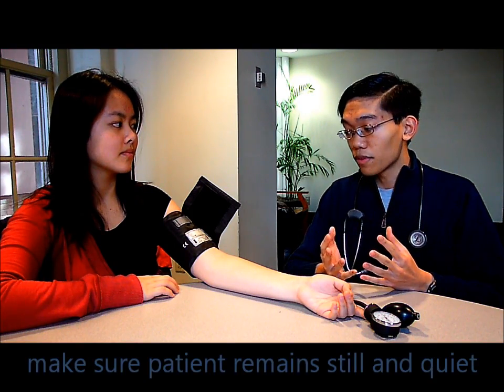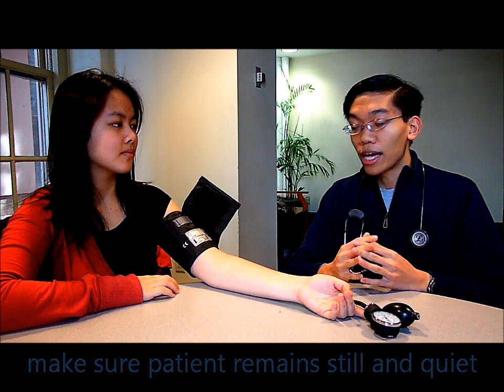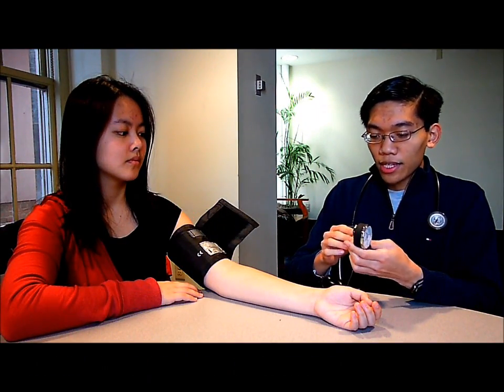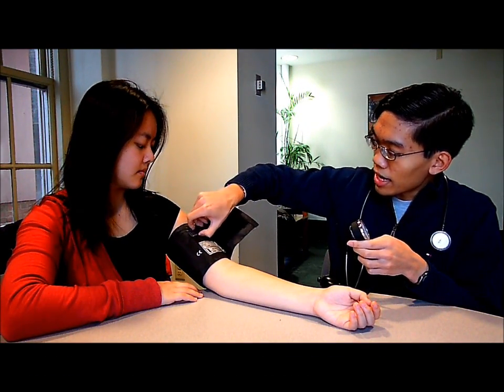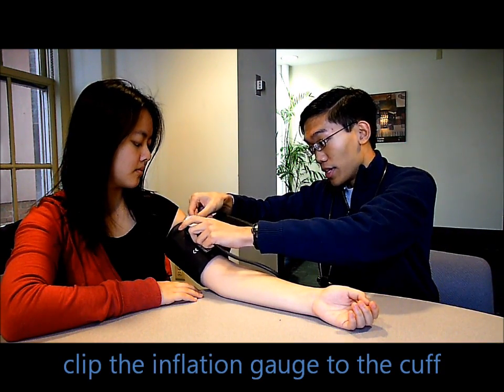Orient the patient and let them know that they will feel tightness and discomfort in their arm temporarily as the cuff inflates. Ensure that the patient doesn't move the arm or talk as you're taking the reading. The inflation gauge has a clip, and there's a corresponding tab on the cuff where you can attach the gauge for easier reading and viewing.